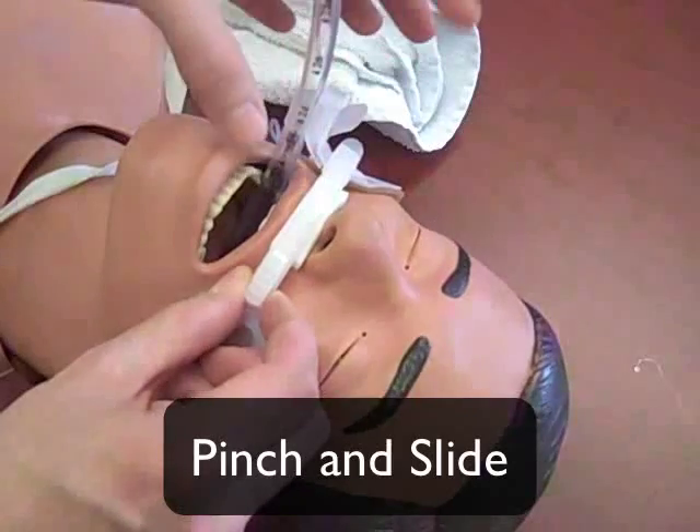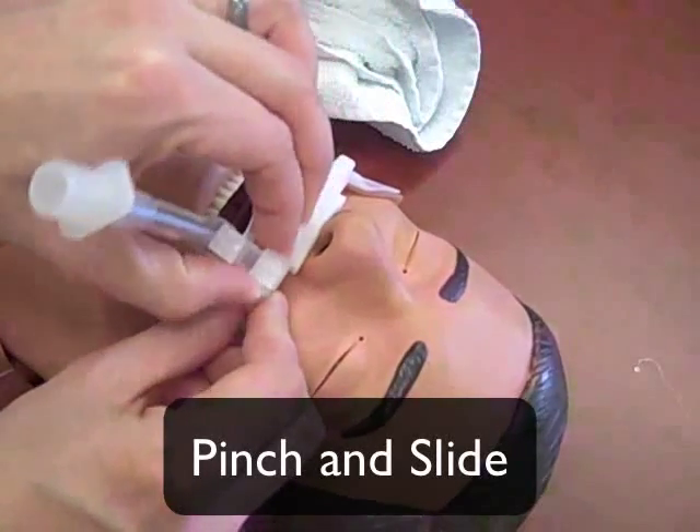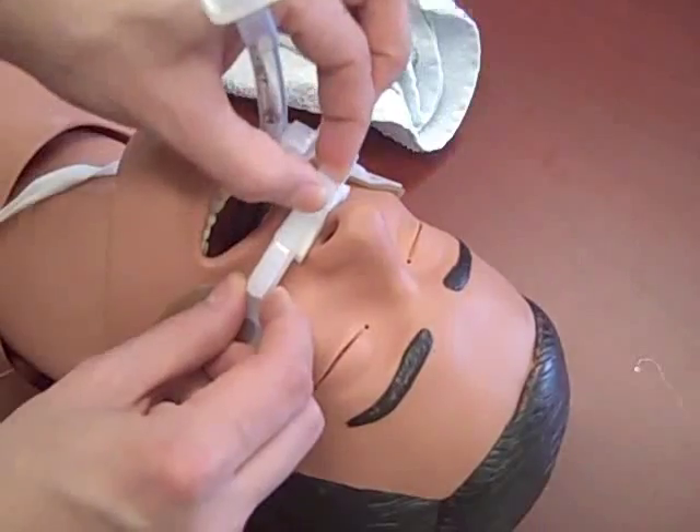The next strap is a safety feature and not the primary securing mechanism. Make sure you can only fit two fingers between the strap and the patient.